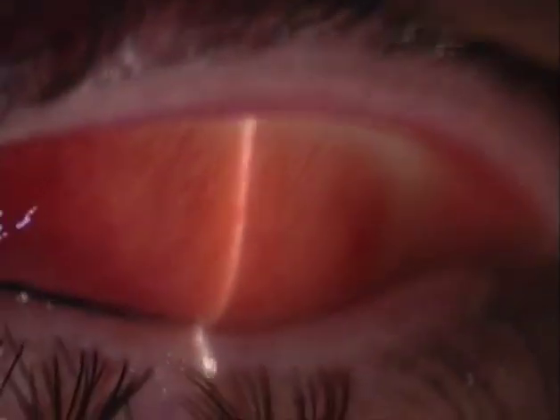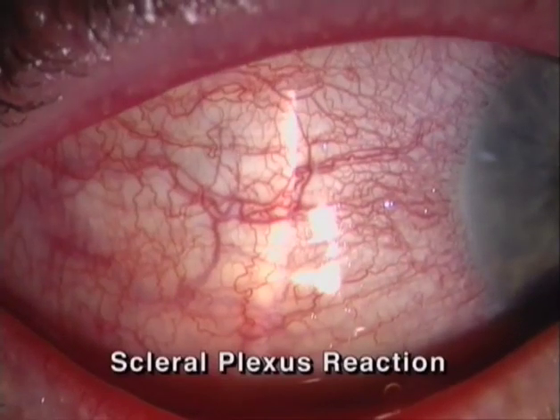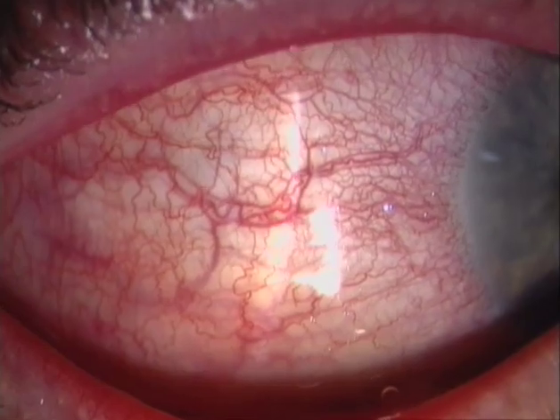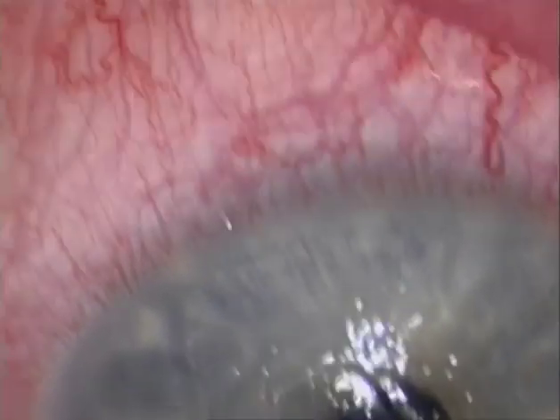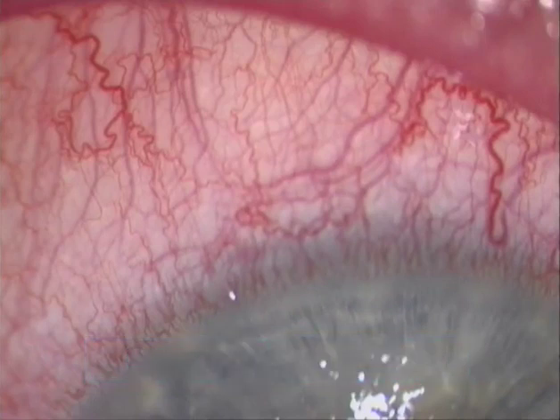And typically, acute conjunctivitis involves also the upper tarsus, where the entire surface is covered by a carpet of dilated capillary buds, hiding the large tarsal vessels and the glands. By contrast, in scleral plexus reactions, only the area close to the limbus is affected, such as here in a case of corneal inflammation. The deep vessels appear with a bluish tinge. Compare this with the bright red color of the superficial vessels.